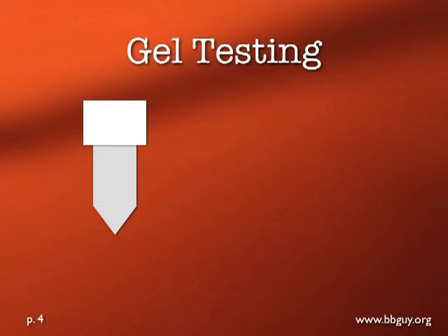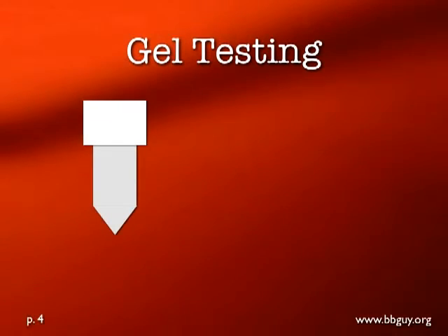All right, so gel testing, on the other hand, is an alternative to tube testing that we covered the very, very bare basics of last time. But let's talk in a little more detail here. Basically, gel testing is done in little individual microwells, or microtubes, I should say, and those tubes contain an actual gel, which is a semi-viscous solution basically, and that gel in general, in the most common way this is done, is impregnated with anti-IgG.